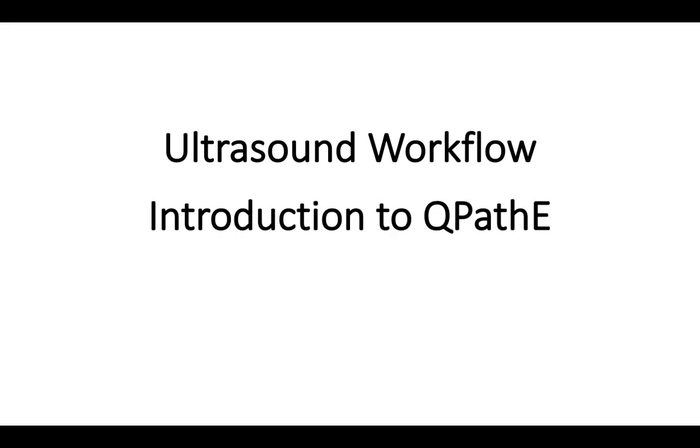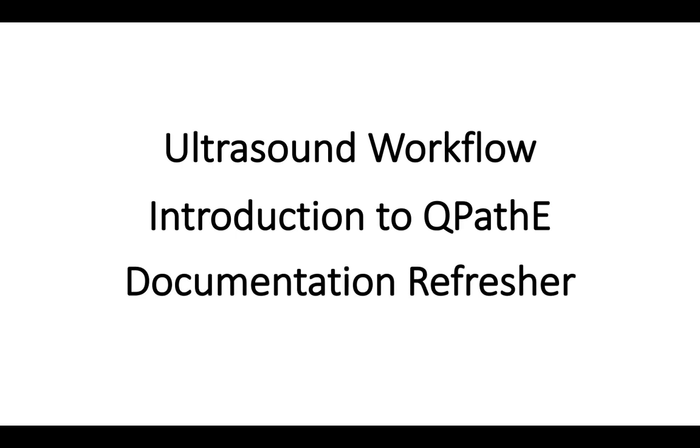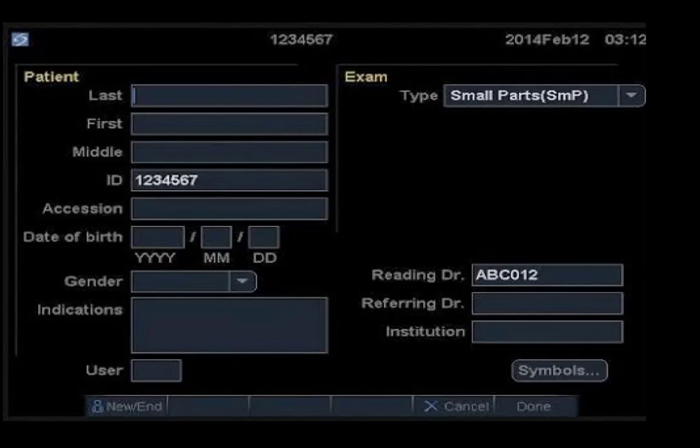We're going to cover three things in this presentation. First, the standard ultrasound workflow at UW, next, an introduction to QPathE, and last, a quick refresher on documentation.